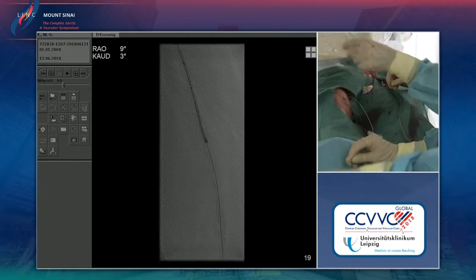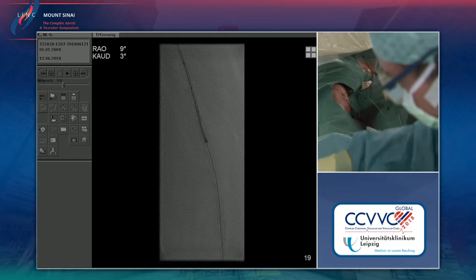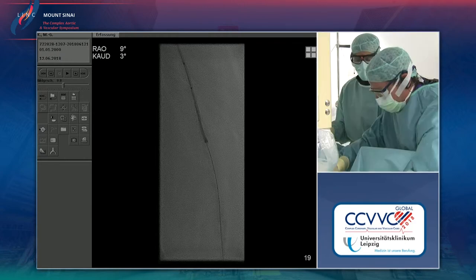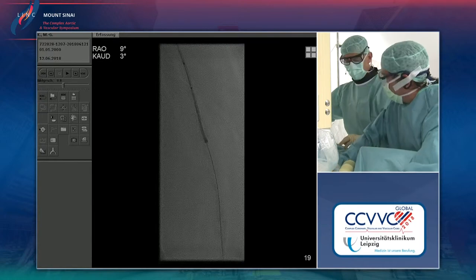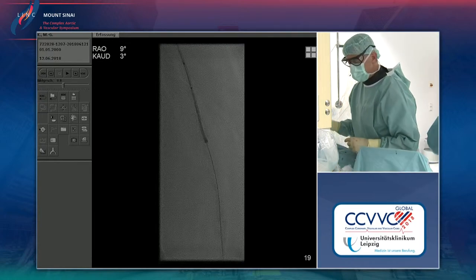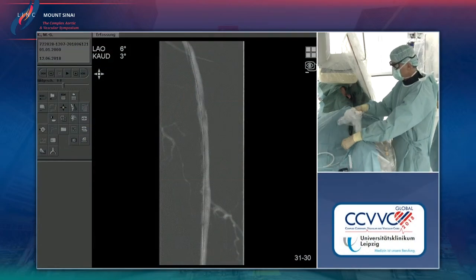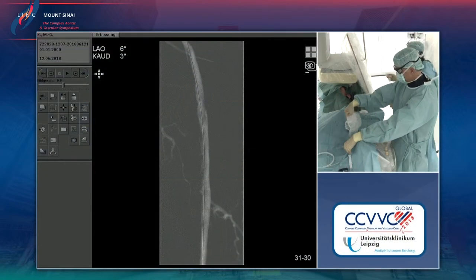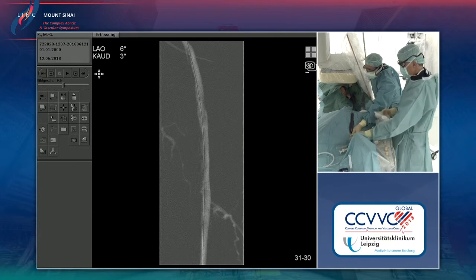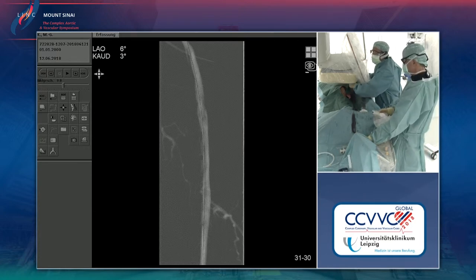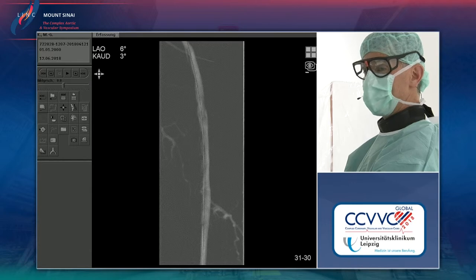Now we prepare the vessel for stent implantation. Andre shows the steps that have been done so far — we had the wire through and then we pulled down our balloon.